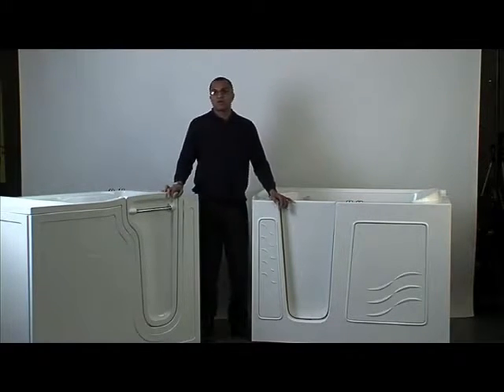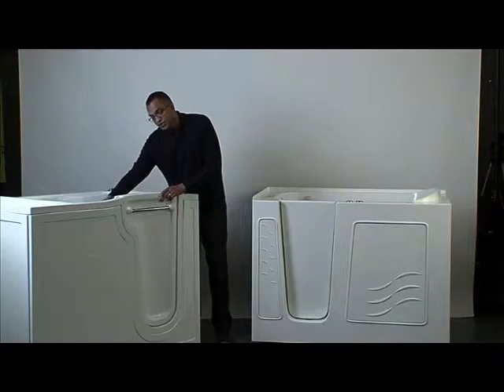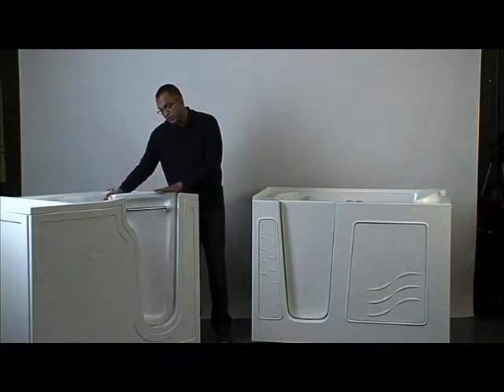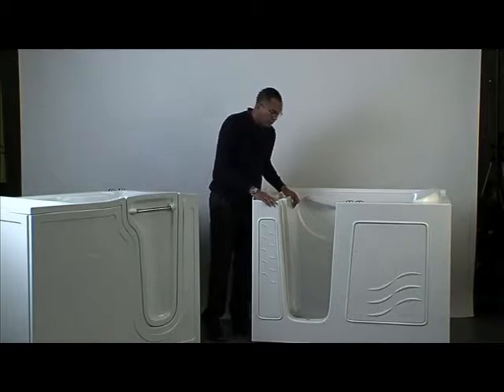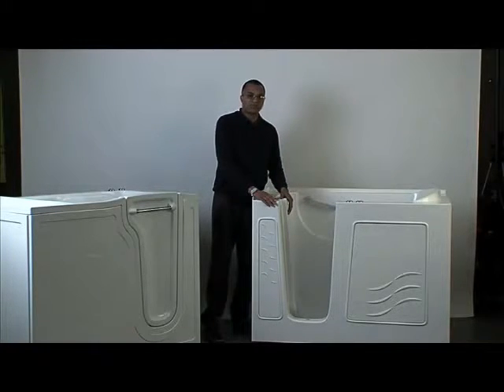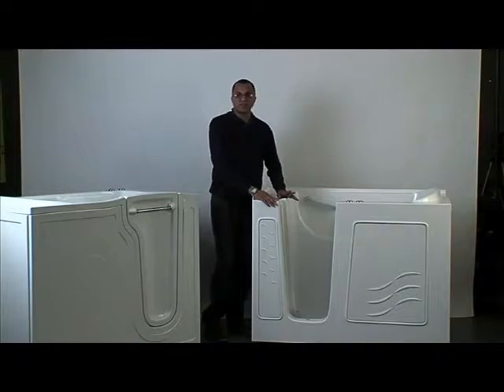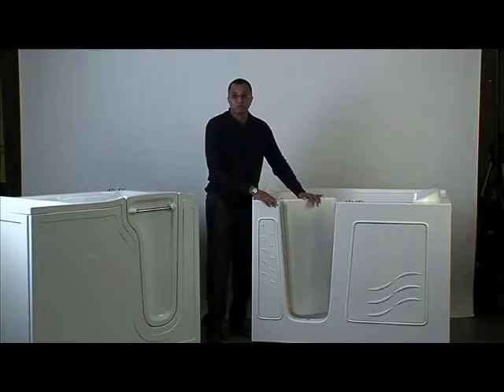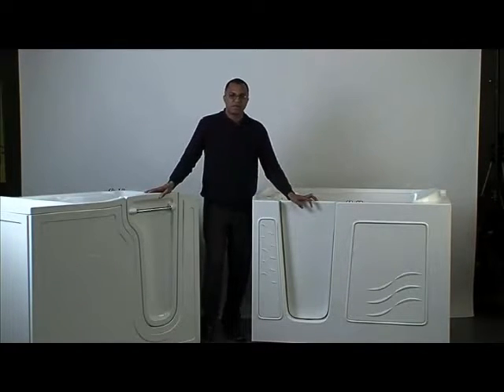When we talk about other hardware, with the Restore we have stainless steel two-part hinges. Those are really great because they allow you to easily remove the door for cleaning and repair — very simple to remove. When we look at the Meditub, it's a very different hinge — what you call a piano hinge, connected all the way top to bottom. The problem with it is it makes it very difficult to clean and to repair, and certainly very difficult to remove the door if you ever needed to clear soap scum. That same piano hinge is what you find on the Safety Tub and American Standard units.